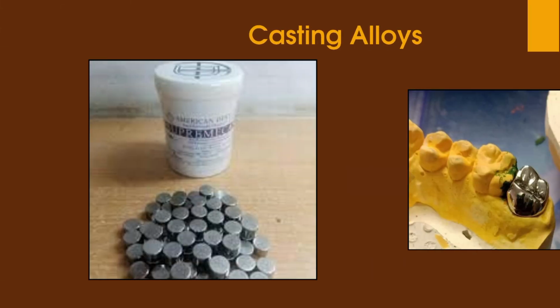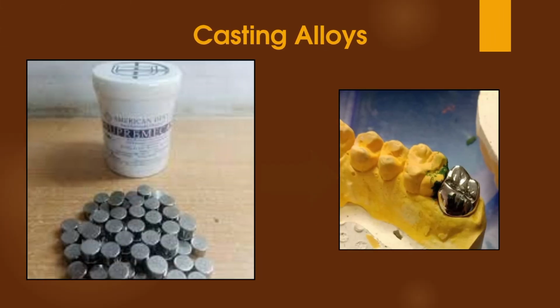What are casting alloys in dentistry? Dental casting alloys are metal mixtures used in the fabrication of dental restorations, such as crowns, bridges, cast partial dentures, metal crowns, and much more. These alloys provide strength, durability, and corrosion resistance. Dental alloys must be able to flow smoothly into molds during the casting process to create precise, detailed restorations that fit the patient's tooth structure accurately.